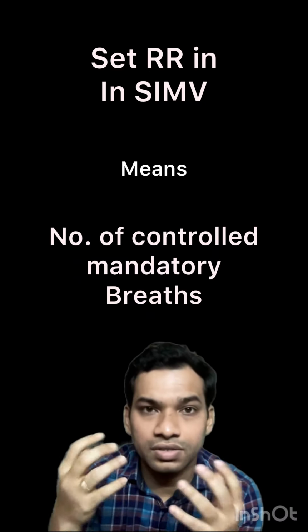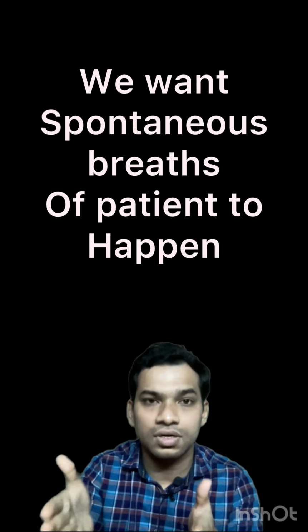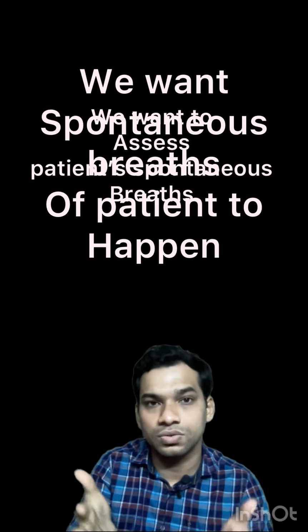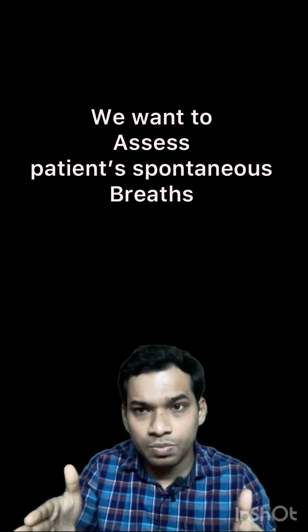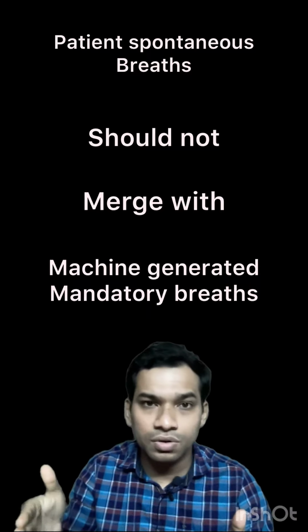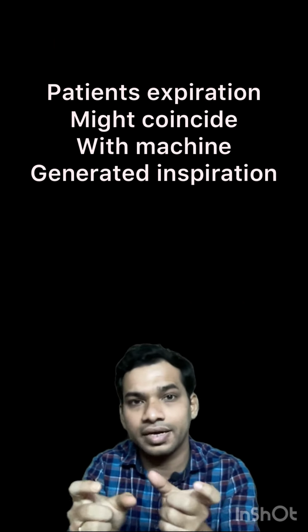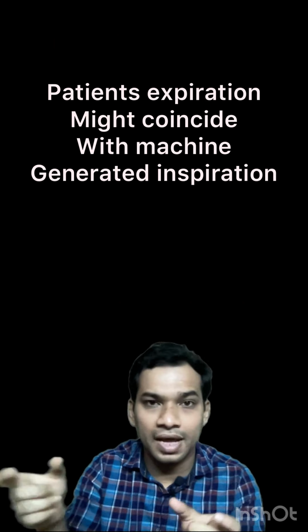But in SIMV, we are trying to allow the spontaneous breaths of the patient to happen. We want the patient to breathe spontaneously. Because we want these spontaneous breaths to happen and assess them, we don't want these spontaneous breaths to merge with the control breaths and create an asynchrony. Because if these partially supported spontaneous breaths merge with the control breaths, the patient's expiration might coincide with the inspiration due to a machine-generated breath and create asynchrony.